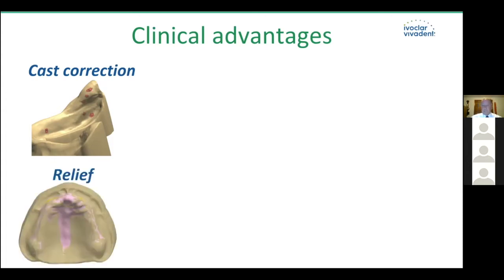Another is the ability for relief to be added to areas of the cast, somewhat according to your understanding of this particular patient, the tissue, how you want to maybe add a little relief over the incisive papilla, maybe over the median palatine raphe, and fill in some of those real deep ditches in the rugae. What this does is block these areas out so that the final restoration is relieved. This isn't a lot of blockout; we're talking microns of blockout, but it's effective.